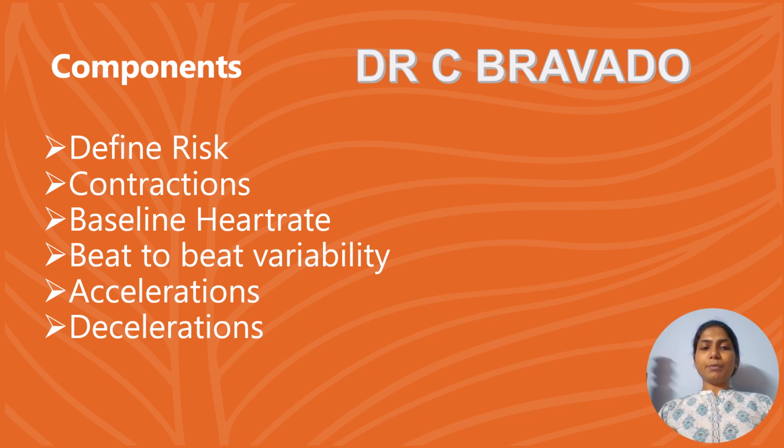The second important thing is fetal bradycardia, that is less than 110. What are the important causes? One is when the mother has hypothermia, hypothyroidism, or if there is any fetal heart block. In an SLE mother, the most common, the Ro and La factors cause fetal heart block.